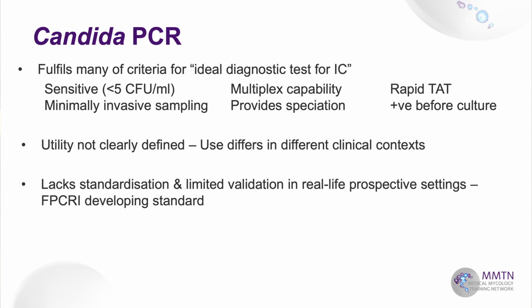So, again, briefly, Candida PCR. Now, the idea of Candida PCR fulfils many of the criteria of what would make an ideal diagnostic test for invasive candidiasis. It's sensitive, it has the ability to be multiplex, offers rapid turnaround times, you can test blood, which is minimally invasive, it provides speciation, often it's positive before culture.